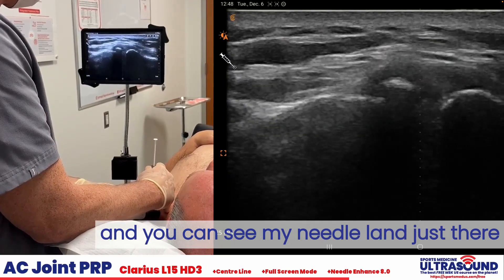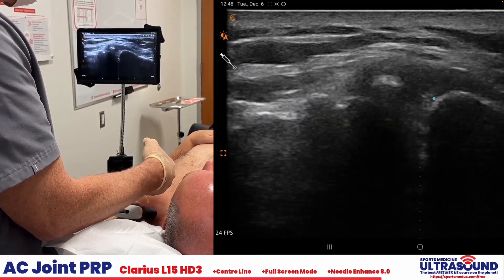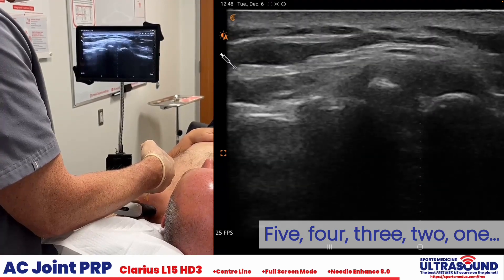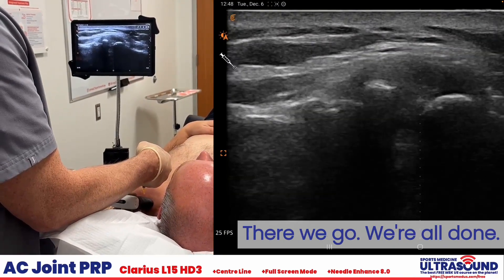You can see my needle land just there at the deep fibers of the capsule. 5, 4, 3, 2, 1. I need to learn to count. There we go, we're all done.